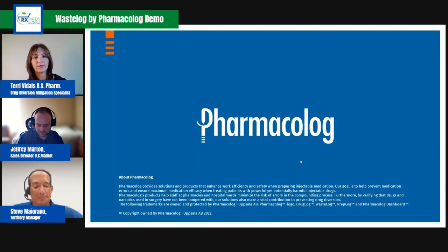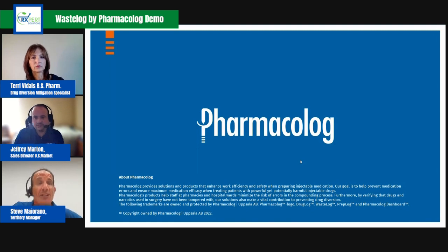So, Terry, that work would be done on the back end with Codonics and the hospital. So if we're using the Codonics label, let's say, when the Codonics label prints out, it prints out at the time of dispensing. So when they dispense a controlled substance out of the anesthesia workstation, a label from Codonics will print out after they scan what the drug is.